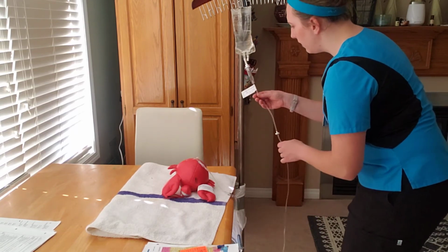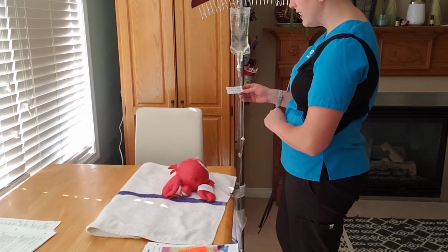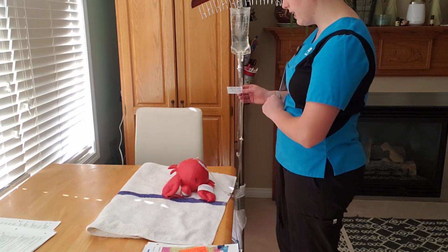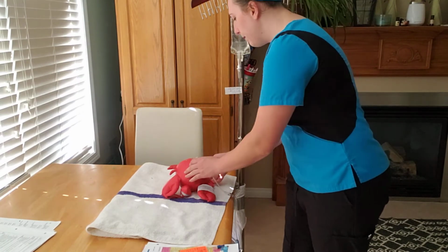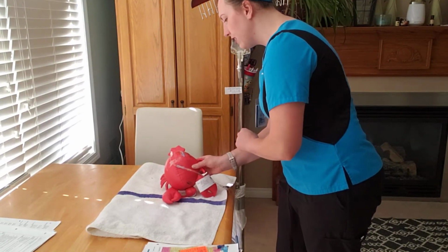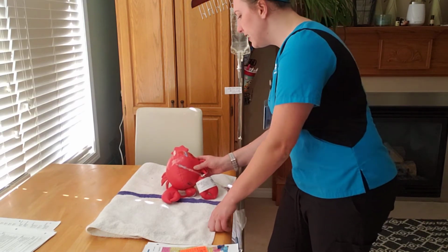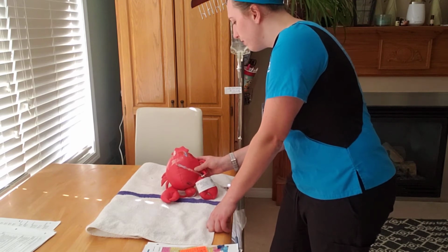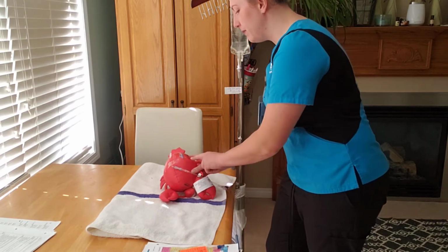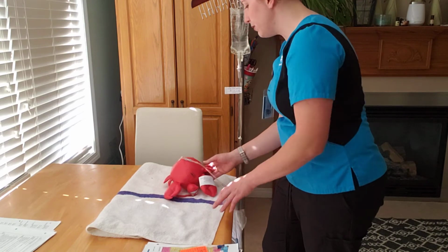Okay, and the current solution is labeled here on the primary line of sodium chloride 0.9% at 30 mL per hour, and this was begun this morning. As well, I'm noticing that the dressing is intact. I can see right through it and everything looks good. The skin looks really good. Again, no ecchymosis, swelling. The site looks very healthy, an ideal site. And this site was started this morning as well at 0400 hours when she was admitted.